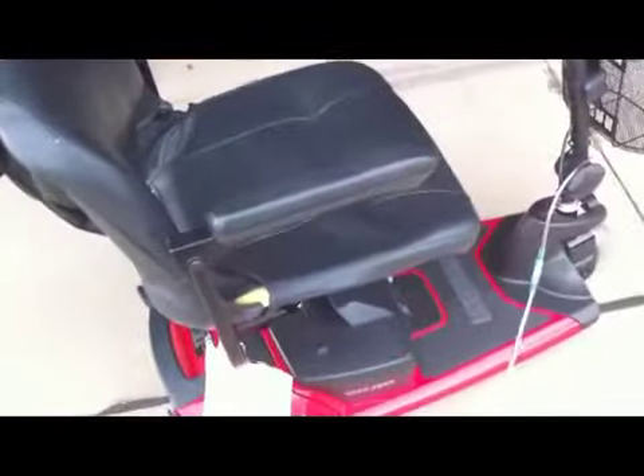Back here, this is just a packet that you keep your charger in and everything. It's on the back of the seat, so you always have your charger with you. Don't go without it, because you're bound and determined to need it if you don't put it on there.